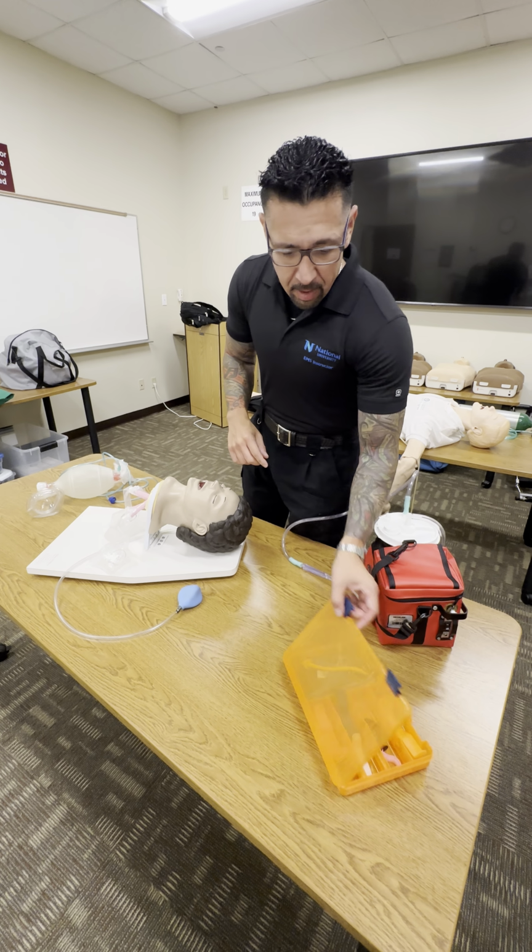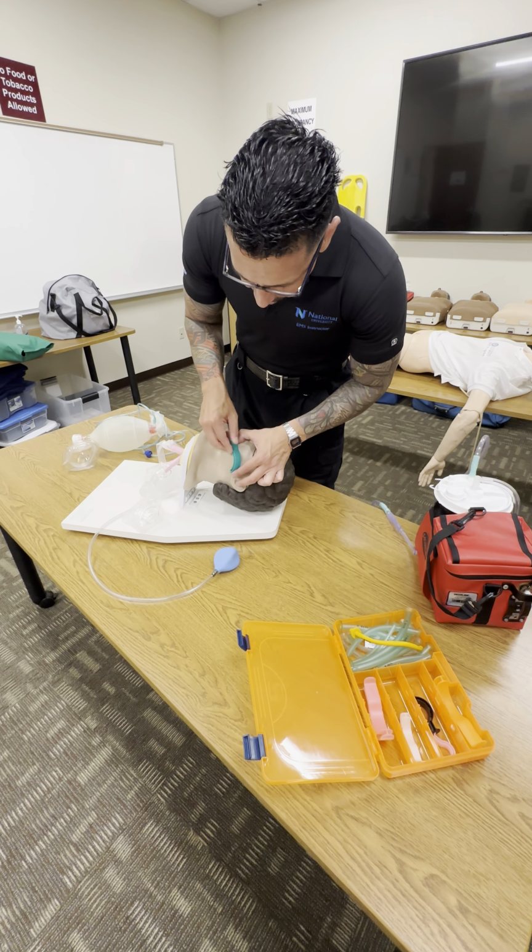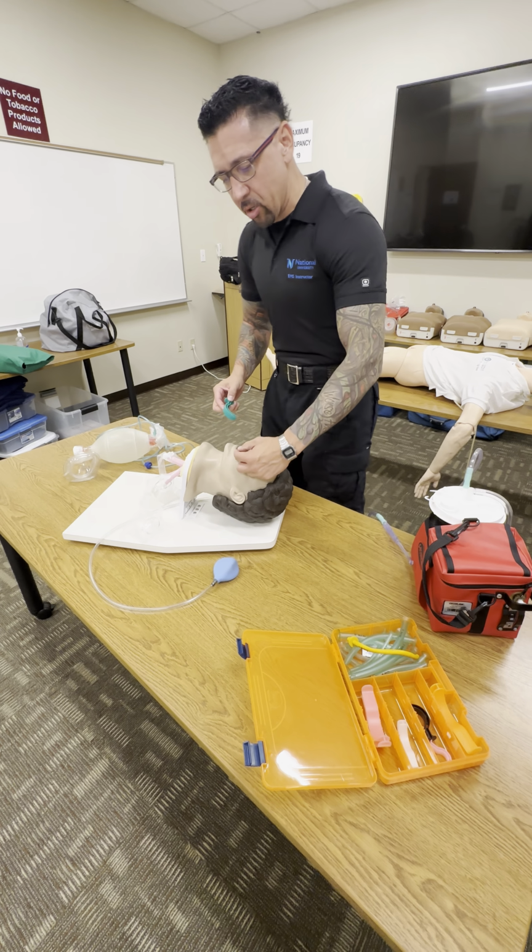At this point, I'm gonna measure an OPA. I'm gonna measure from the corner of the mouth to the earlobe. This one looks like it fits. I'm using the cross finger technique.